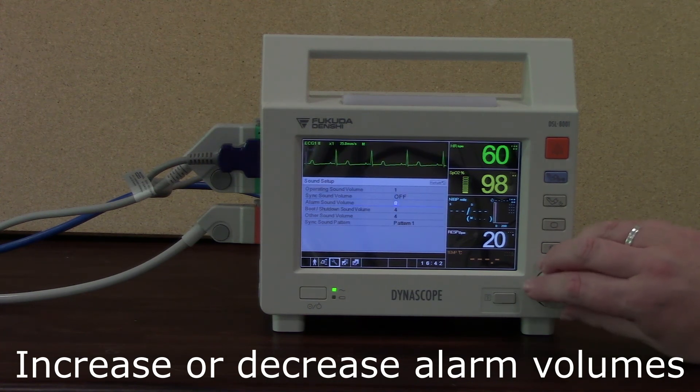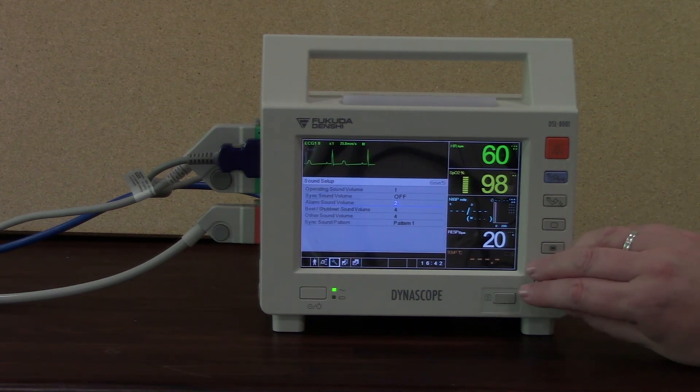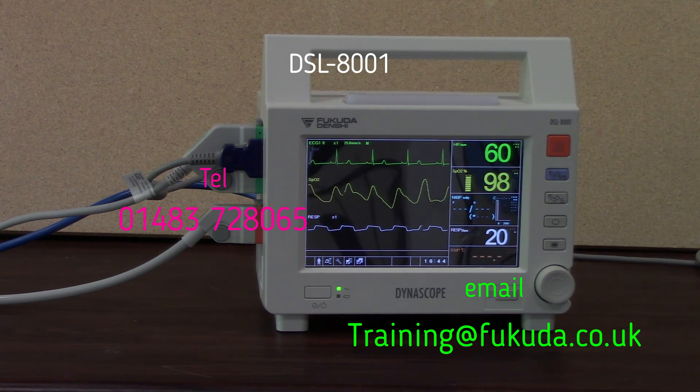That's the end of the short training session on the DSL8001 bedside monitor. I hope that it's been useful for you. If we can offer you any further help or assistance, please contact your clinical support specialist on telephone 01483 728 065, or you can email training@fukuda.co.uk.